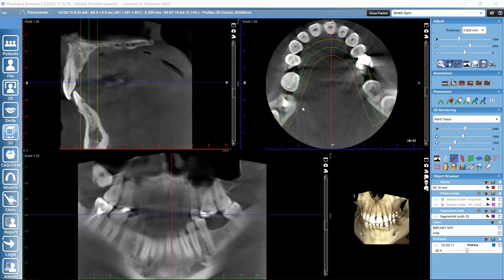Let's first take a look at the views we see here. We have the axial view, the sagittal view, then the panoramic view, and then the 3D rendering here in the corner.